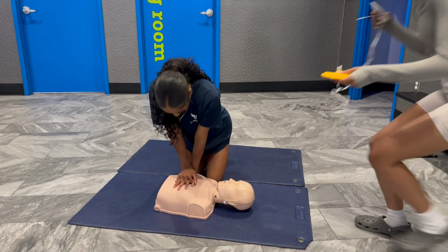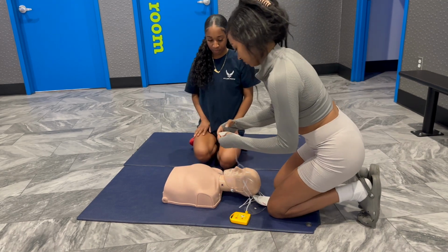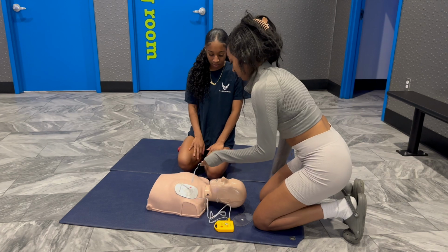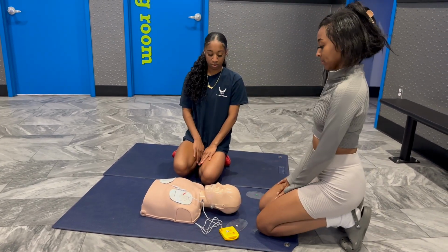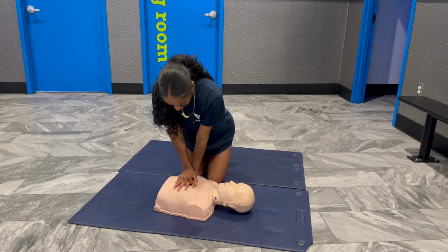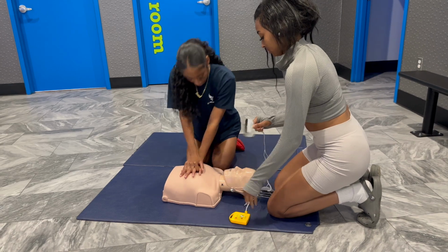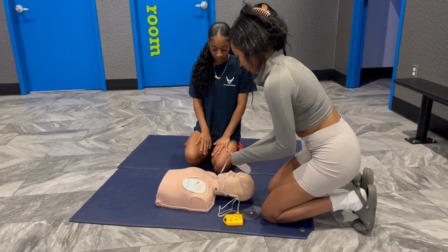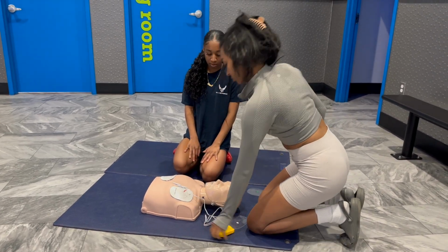If you are providing chest compressions, that means that the victim's normal heart rhythm is malfunctioning and you need to restart it. This is done through the use of an automatic external defibrillator or AED. The diagram on the AED will tell you where to place the 2 pads on the victim's chest. Turn on the machine and make sure no one is touching the victim. The AED will analyze the heart rhythm and tell you what to do, whether it is to provide a shock or to continue chest compressions.